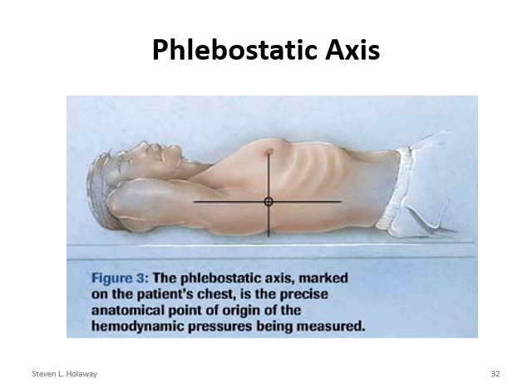If our transducers are too high or too low, we're going to get false readings. So every shift is going to level their transducers with that phlebostatic axis. Just like we talked about when we talked about our patients going for a PCI, and we mark their pedal pulses so that we can find them when they come back. It's not a bad idea for the first person that does this to actually mark that area, and then everyone can measure and level to that same area. That way we get consistent readings and we can follow the trends of the readings.